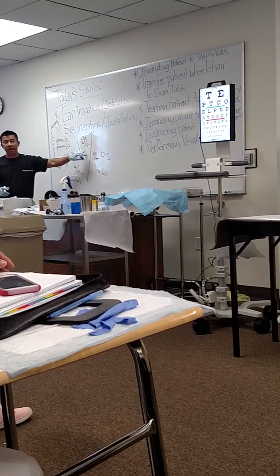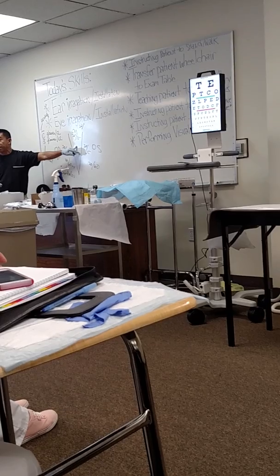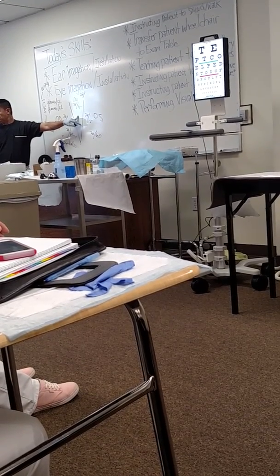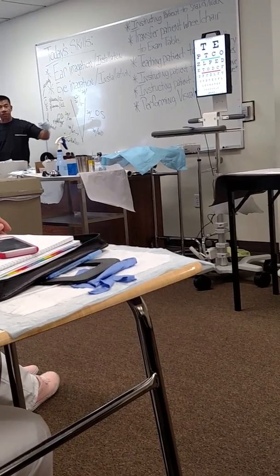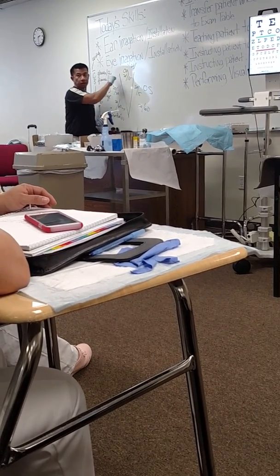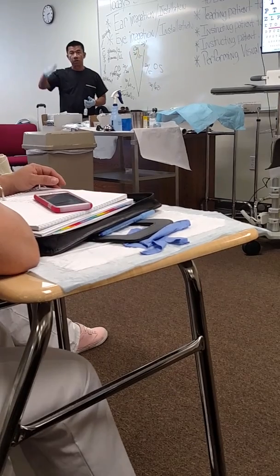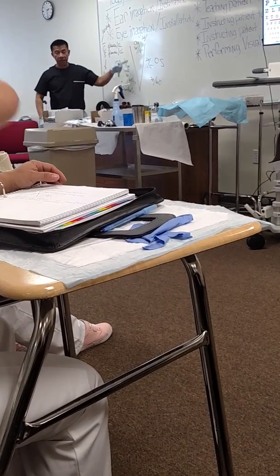20/15. Now, the purpose again, like what I said, why the doctor or the clinic wants you to check this, is that your baseline is very important. If the patient is undergoing a procedure and comes back and their vision is now 20/50, without the baseline you're in trouble, because when they came in it was 20/15. What happened? Also, some clinics have a pre-stamped form that has all of this already. They stamp it and you just enter the values. There are things like that on the progress note. If it is an electronic medical record, they will also set it up with a template where you just enter the values of your reading. You don't have to make it up.